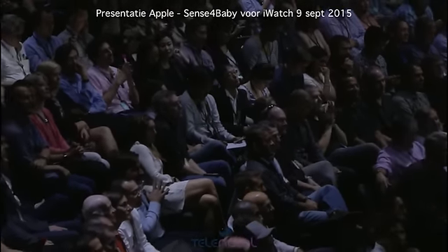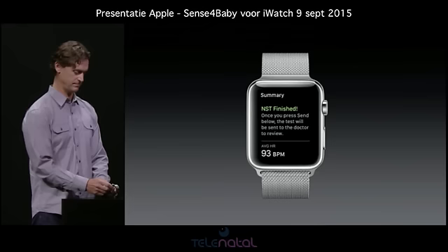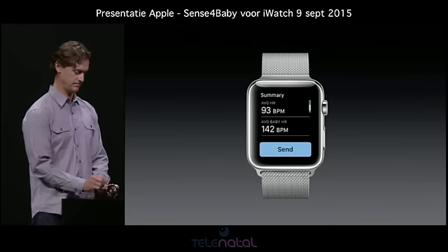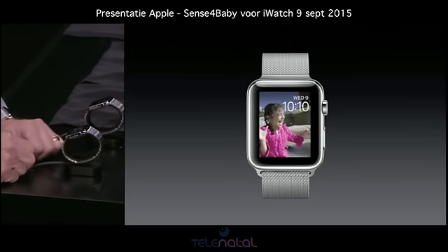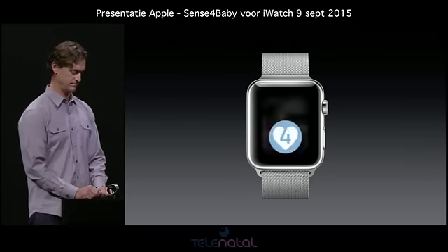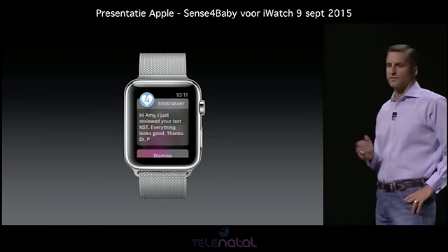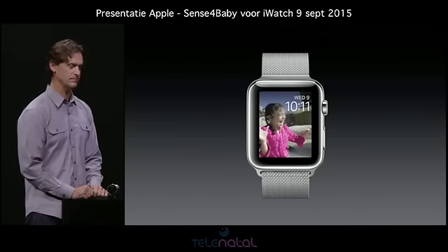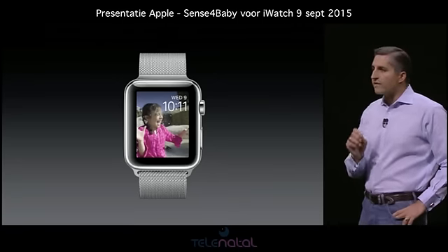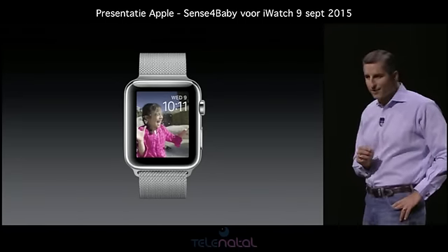Thank you. It's really cool, isn't it? Now, when the test is done, she can simply send all that data from her watch back to her doctor. And then later that evening, she gets a message from the doctor telling her, I've read your NST, your baby's doing just fine. So Airstrip plus Apple Watch together will redefine how messaging and communication occurs in healthcare. Thank you very much.